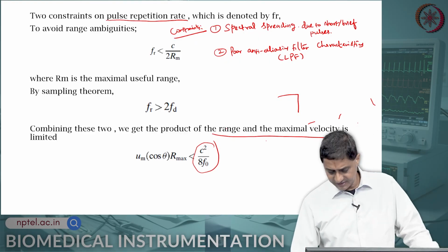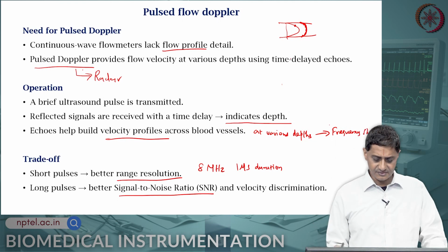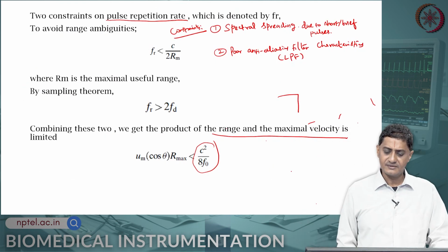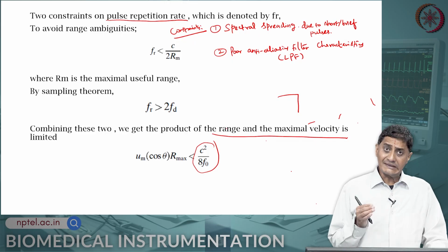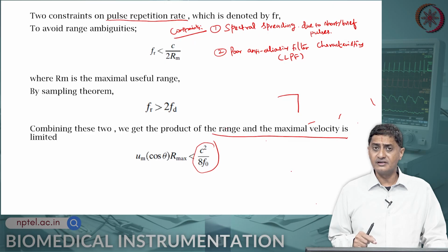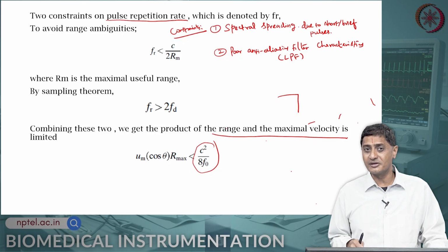The other thing we discussed previously is that 1 microsecond duration: the electrical circuit can be switched on or off at 1 microsecond, but the acoustic crystal cannot turn itself off immediately within that 1 microsecond.